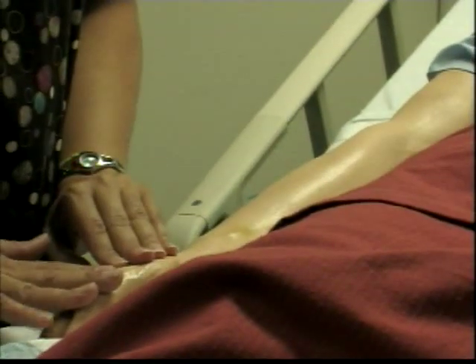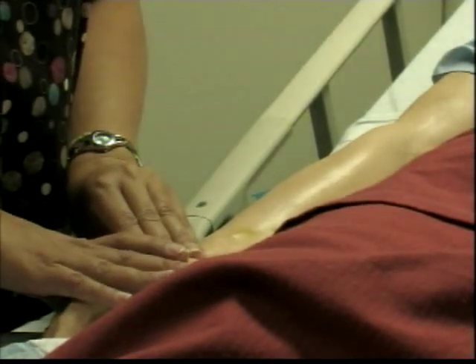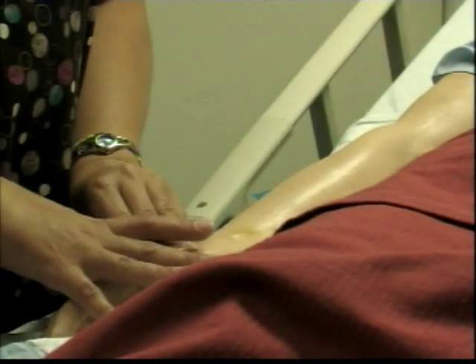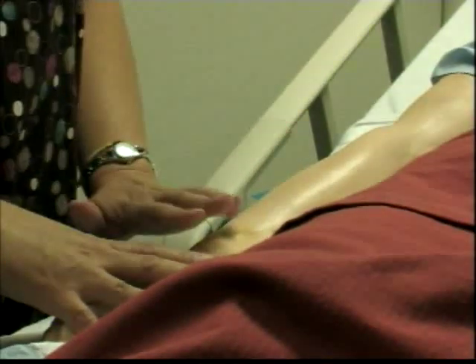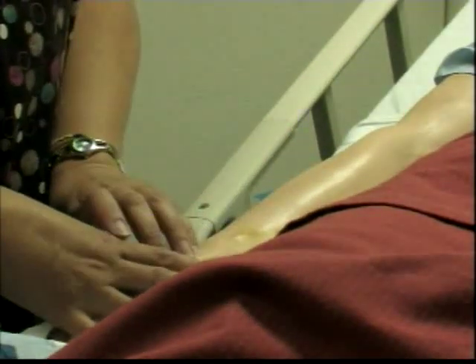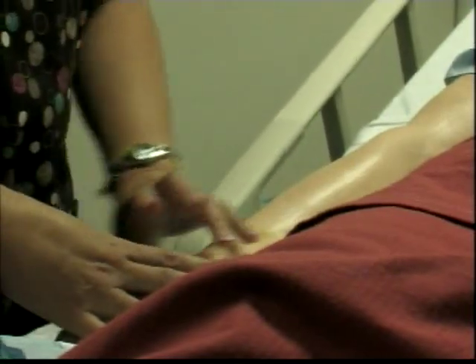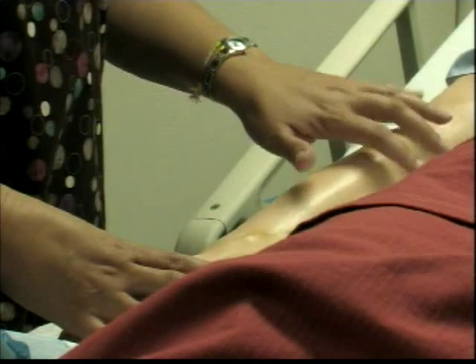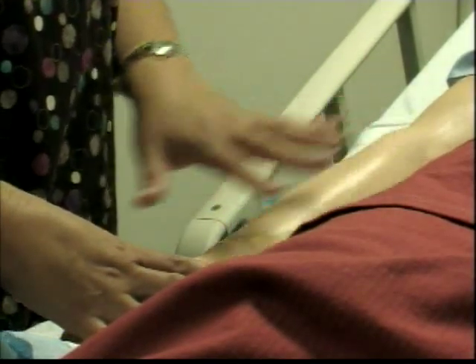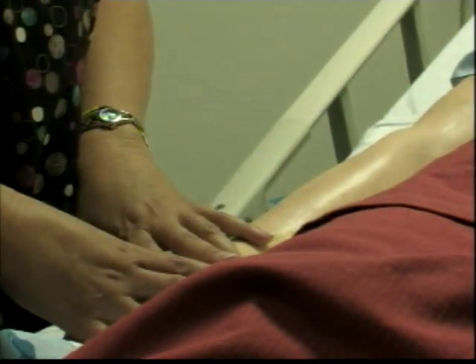You want to start from distal to proximal, because if your IV site infiltrates on the hand, then this is going to need to be rested, and you want to put either hot compresses or cold compresses. Then you can actually use the same vein but a little bit higher because it's not going to disturb what it's already infiltrated. So you'll have the ability to move up and still maintain the integrity of the IV and to prevent any more complications on your client.